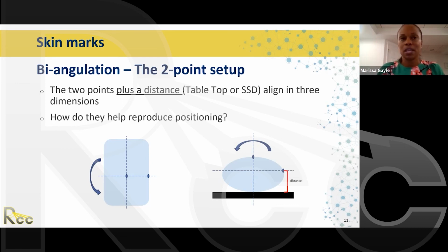Some of them will get on the table and we'll make a mask and they'll be fine and they can do it with minimal encouragement. We like to put stickers, candy, we bribe the kids, to be quite honest with you. If it's something like a 2-site SBRT where they're going to be on the table for a long time and really can't move, they'll also be a candidate for the sedation team.